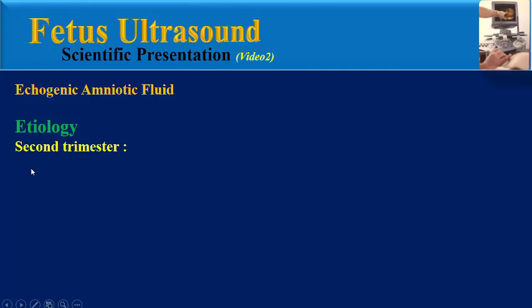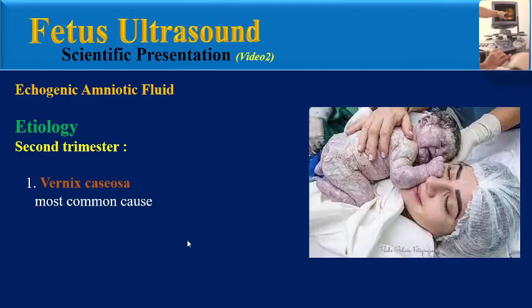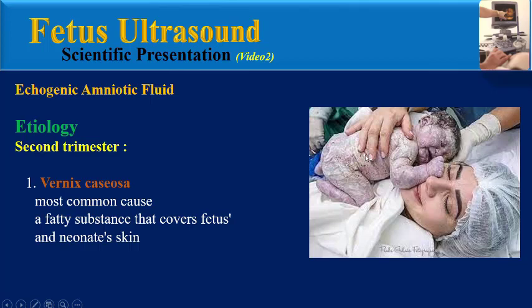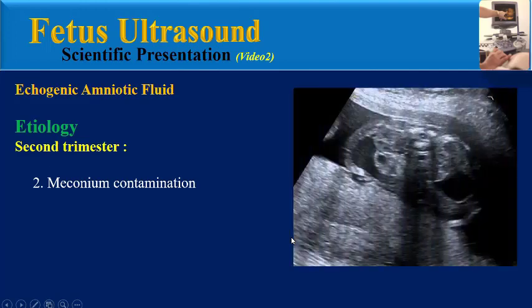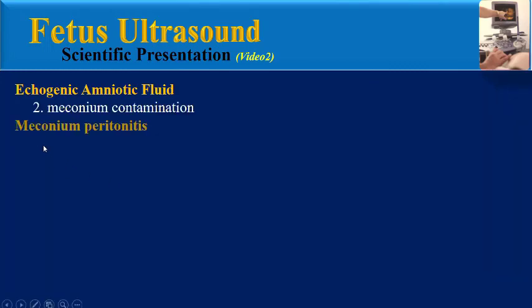In the second trimester there are many causes of echogenic amniotic fluid. The most common cause is vernix caseosa, which is a fatty substance that covers fetal and neonatal skin. Another cause is meconium contamination. This is a good opportunity to have a brief overview of meconium peritonitis ultrasound findings.